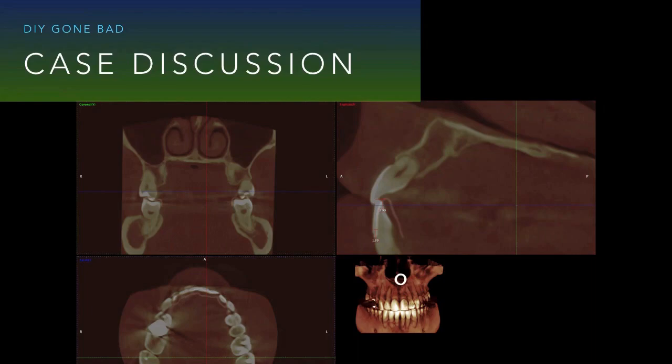We can also see the amount of wear that had occurred and how that tooth has now been thrown into traumatic occlusion. And even at the CEJ, it was pushed forward about 1.5 millimeters or so. So in this case, I think she could have prevented having harm done to her by this aligner company by, one, going to see an orthodontist, but more importantly, just having knowledge of what the bone levels are around teeth and knowing how to proceed in those cases.